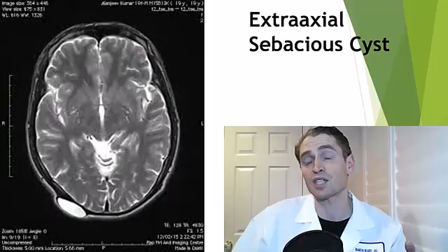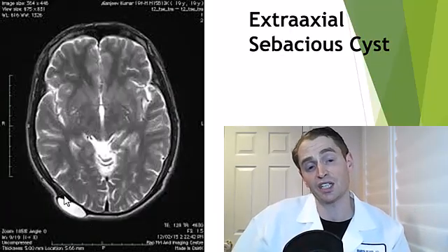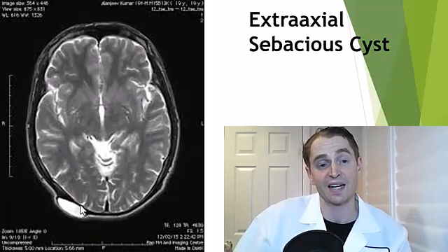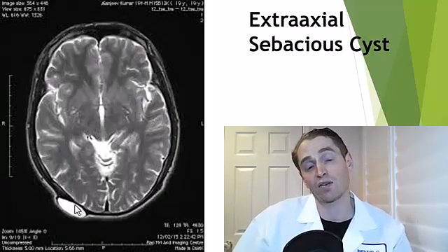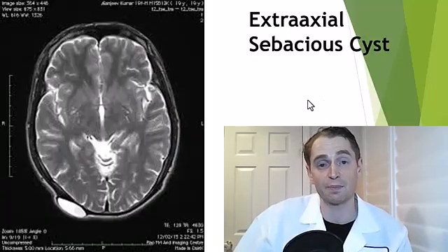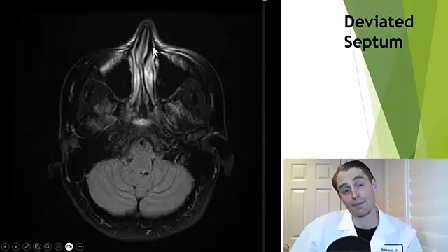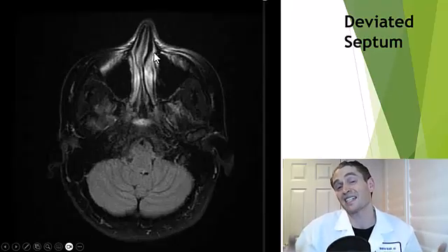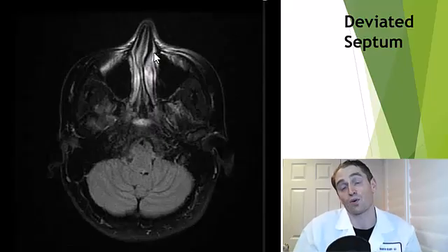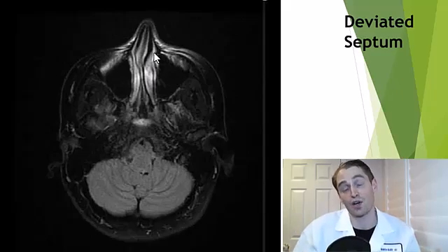Lastly, we sometimes see things outside of the brain. Here is a sebaceous or sweat gland cyst that's actually outside of the skull, though it could be surgically removed if it's causing symptoms. On this MRI, we can see a prominent deviated septum — a fairly common incidental finding, even if the person isn't complaining of any breathing difficulties. Deviated septums are quite common and don't necessarily change the external appearance of the nose.